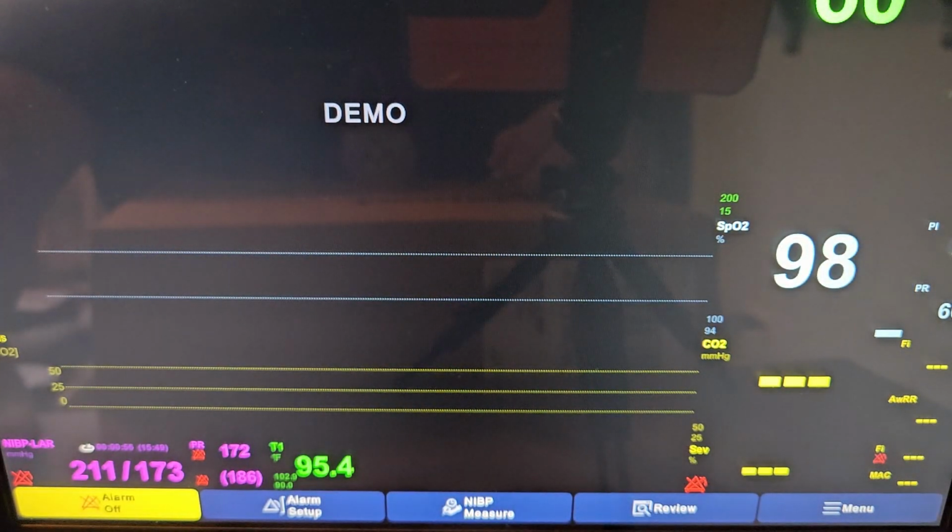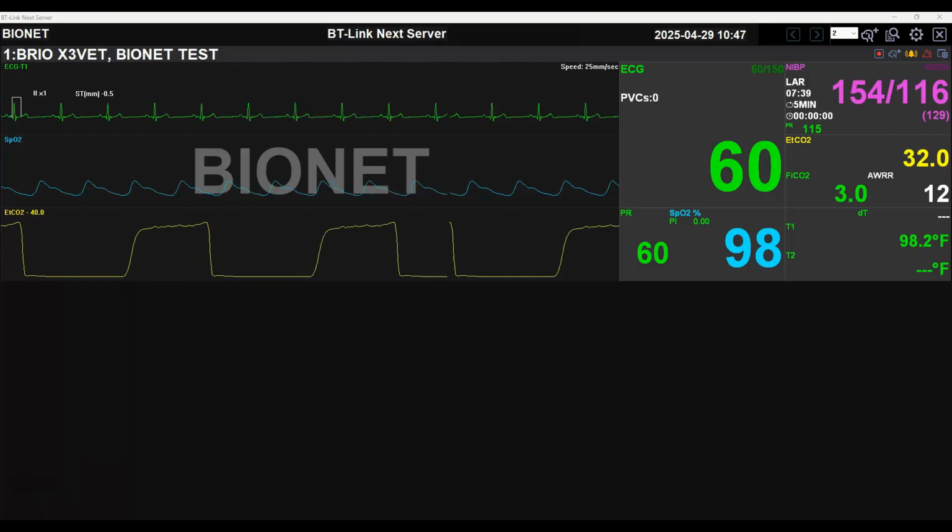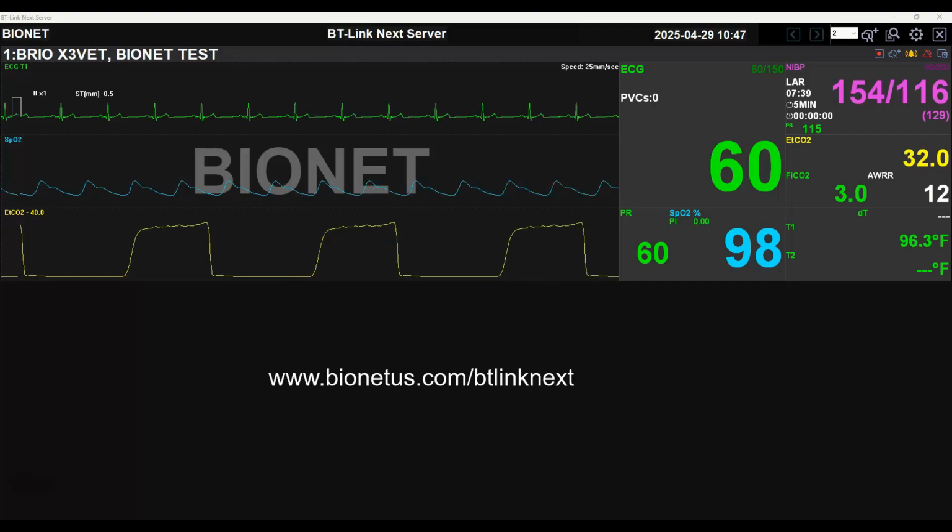Your monitor is capable of connecting to a desktop computer or mobile device over Wi-Fi using the BT-Link Next or BT-Link Next mobile software. To learn more about and download this free software, please visit bionetus.com/BT-Link Next.